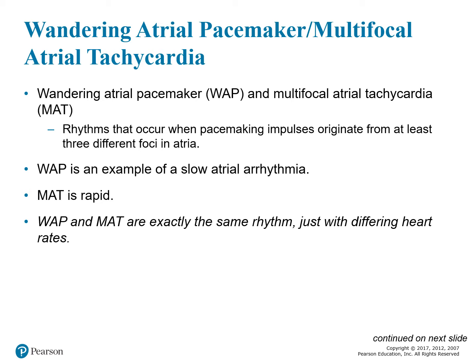Wandering atrial pacemaker has been updated to a new name, the multiformed atrial rhythm. So a WAP can either be called a WAP or a multiformed atrial rhythm.